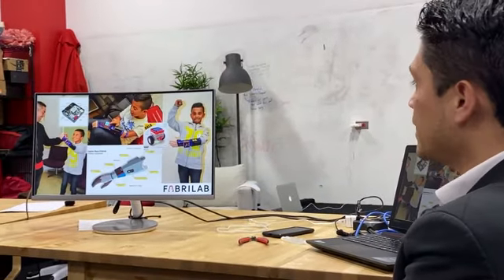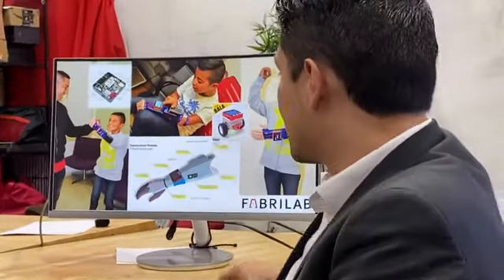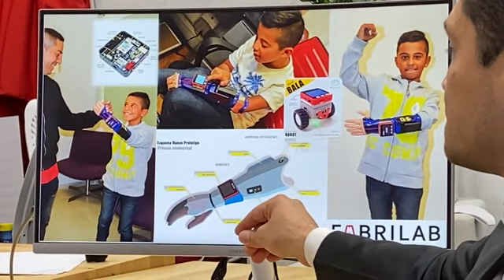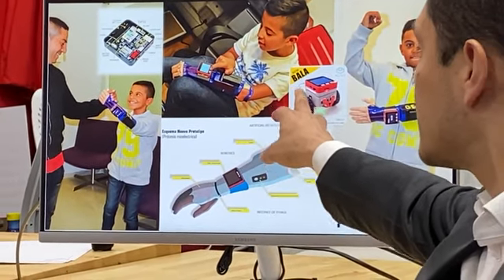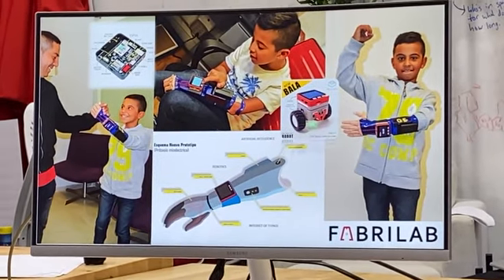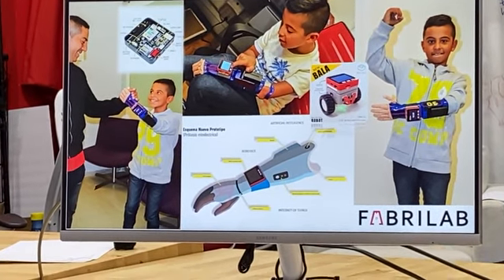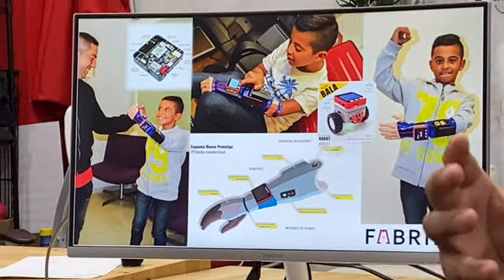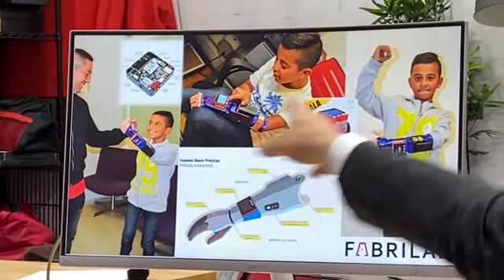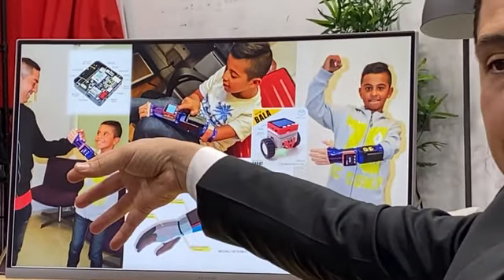Yeah, and the last one, that is our last release, is using a device called the M5Stack. So it is like one Arduino mixed with one Raspberry Pi, you know? You can embed software and a system, and it has a touch screen. So we are using this device to control the prosthesis, right?